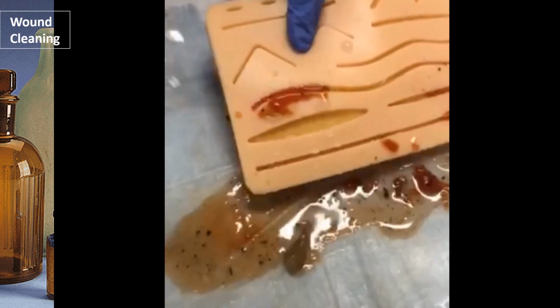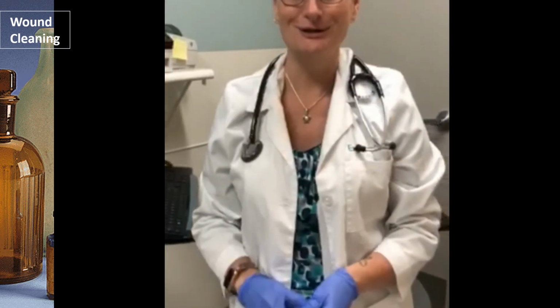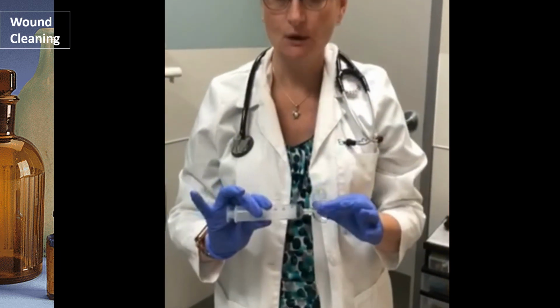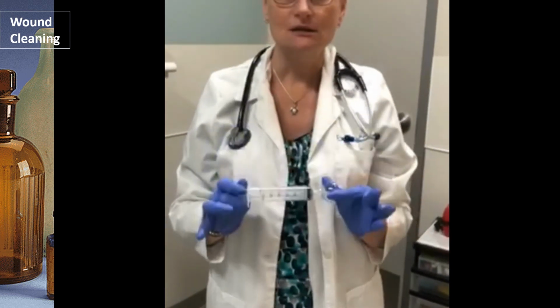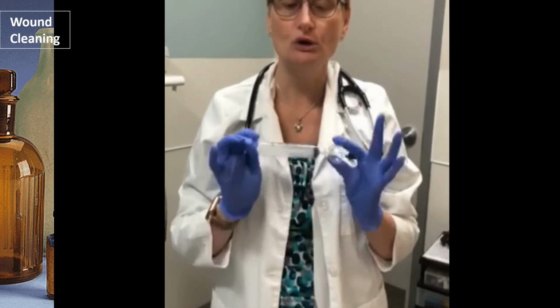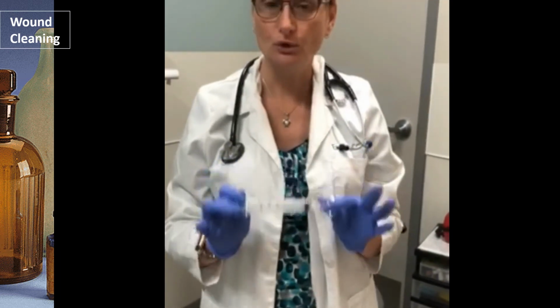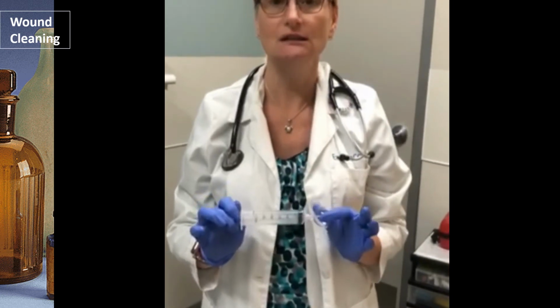Now again, this is on our skin that we're using. Human bodies don't look this good, nor are they this clean. They will continue to bleed, but you really got to do copious amounts of irrigation. We want to lessen that bacterial load. Research says either tap water or normal saline is sufficient, but you want to do copious, and I mean copious. The more, the better. We want to dilute that bacterial load. That's one good way and the best way to prevent laceration-associated infections.